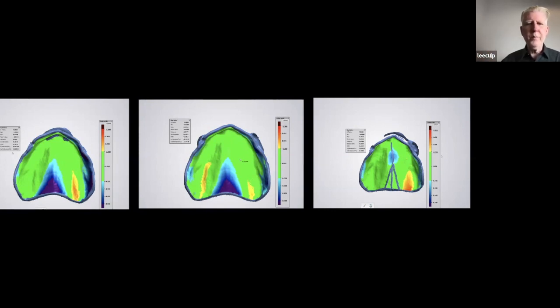And one of the most important parts is that seal on the palatal seal, especially towards the lingual. So we have hot spots in the printing. We have cold spots. Hot spots are high spots. Cold spots are not attaching.